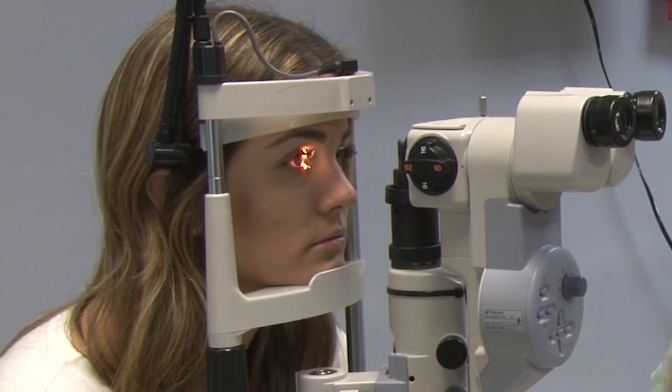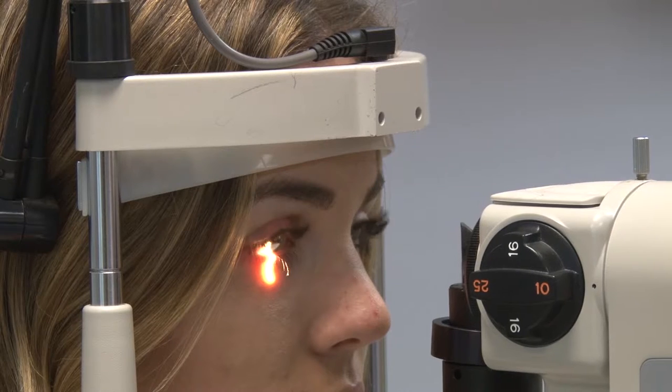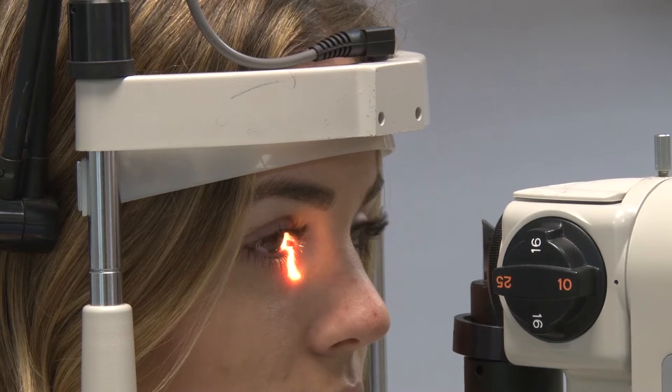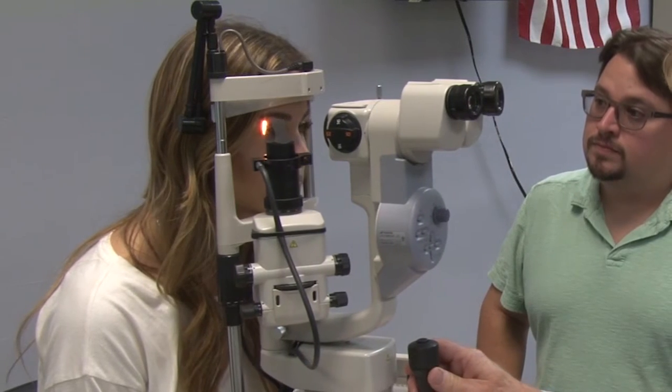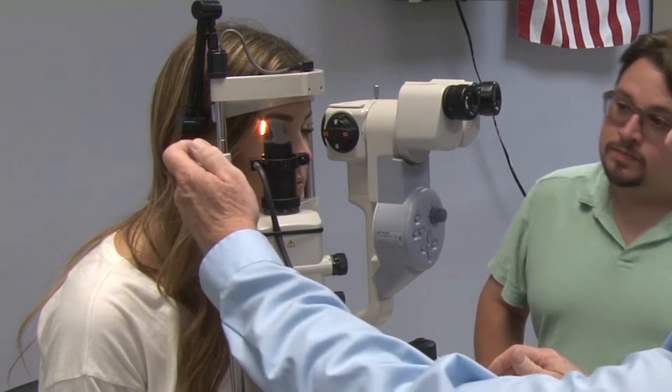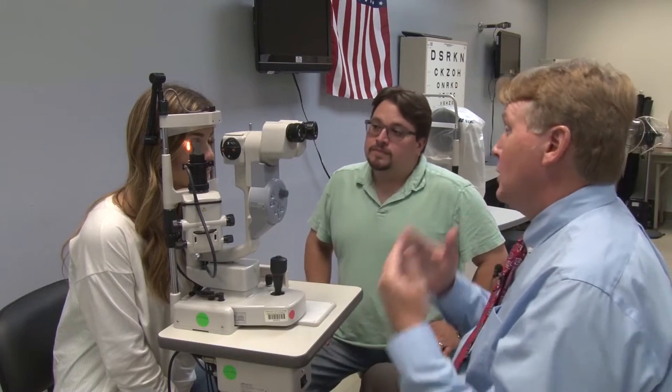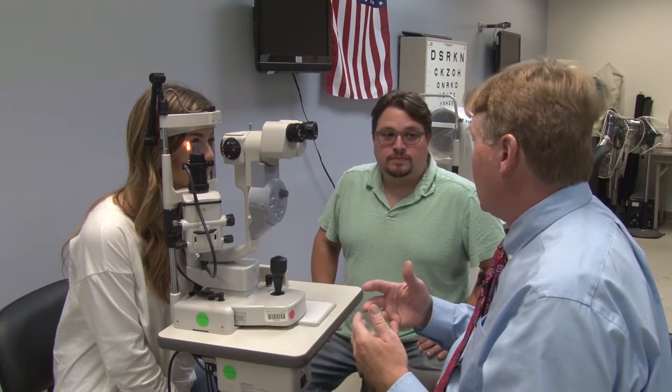To get the most out of your contact lens pre-fit exam, you must start with a patient history. This will alert you to previous diseases and injuries that may be visible during the exam. You must also know the capabilities of the instrument, knowing how to set up various types of direct and indirect illumination. If you always follow a step-by-step procedure, you are less likely to miss something. You should carefully document any concerns and discuss them with the doctor.